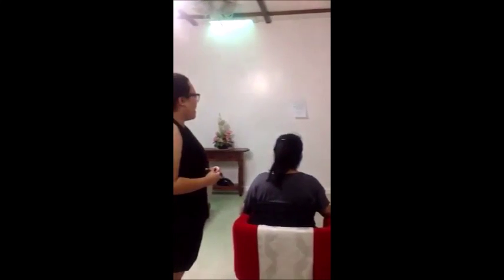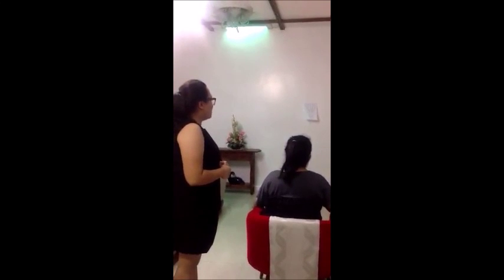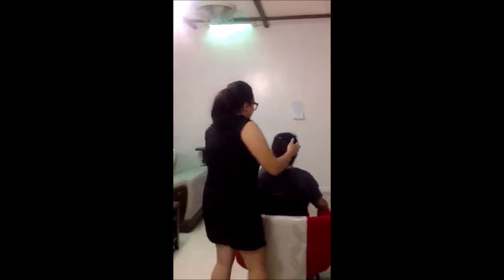To test for the dynamic visual acuity test, ask the patient to maintain her gaze on the Snellen chart. The PT will rotate the patient's head 2 cycles per second and ask her what is the clearest and lowest line she can read. A decrement of 3 or more lines suggests a vestibular hypofunction.